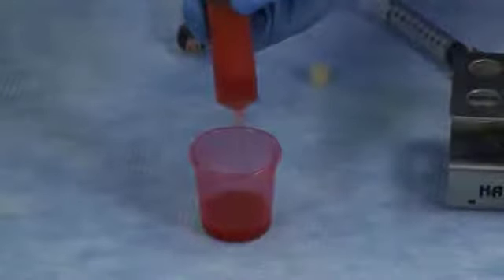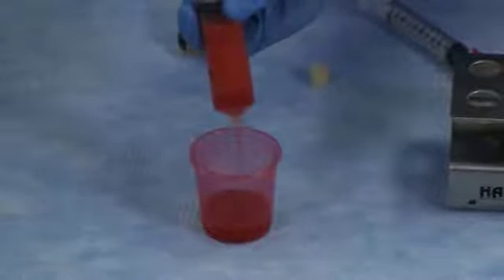Expel the separated infranatant fluid out of each collection syringe into disposable cups.